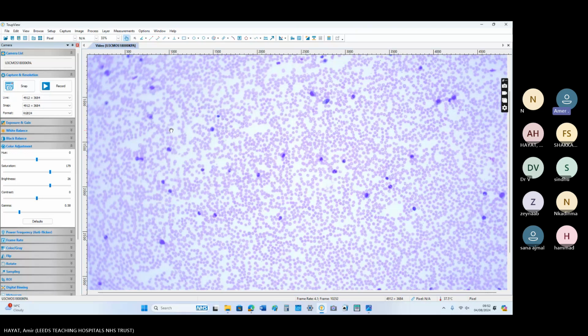When you examine the patient, she has a large abdominal mass on the left side of the abdomen, and there are many lymph nodes in the axilla, the neck area and the inguinal area. The blood film shows some abnormal cells, and the biomedical scientist is worried about what this can be.